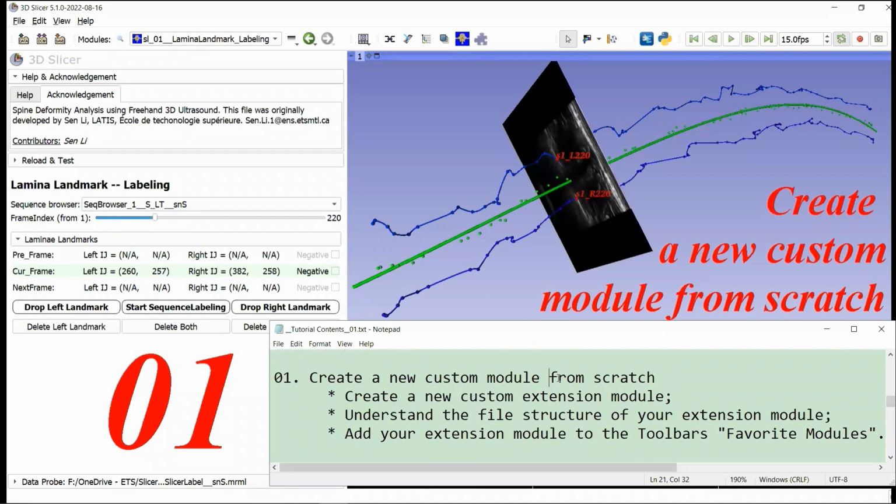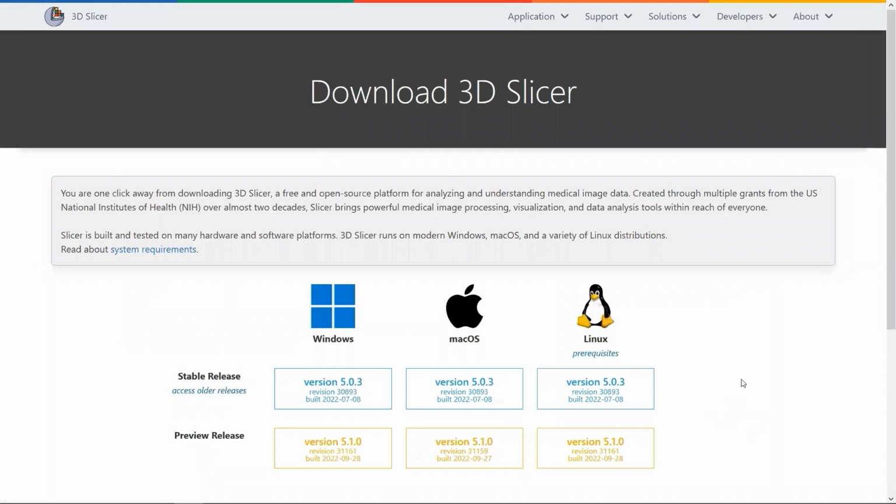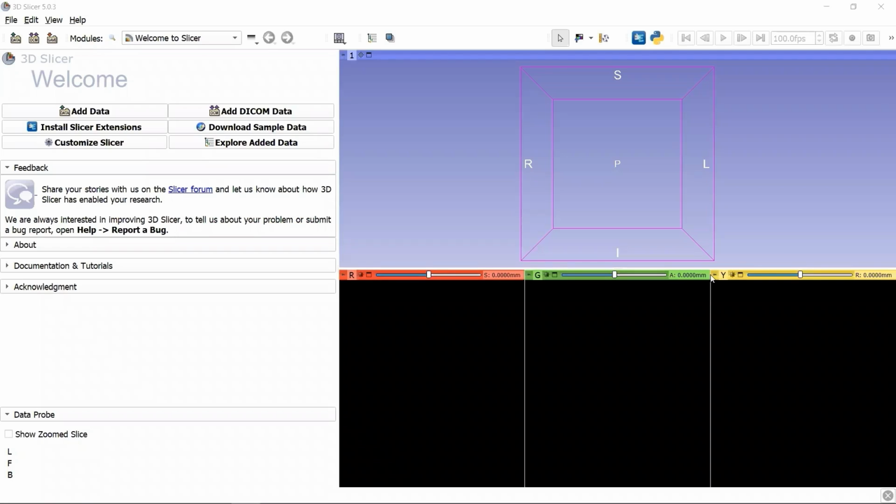To begin from scratch, let's first download the most recent version of 3D Slicer. We Google 3D Slicer, click Download, and then choose your operating system to install. After the installation, you will see the Slicer user interface like this.